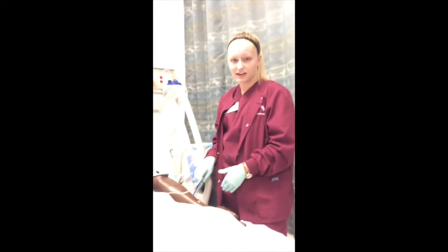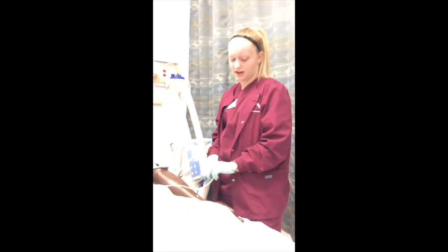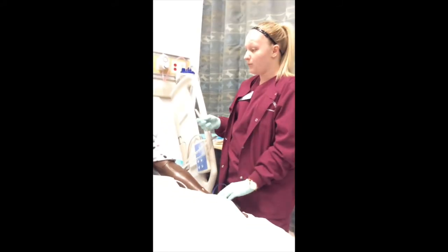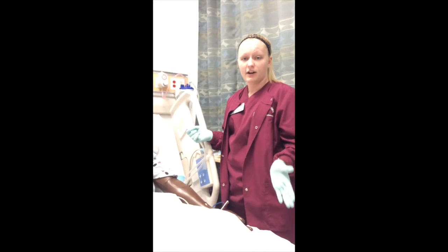Okay, so now I'm going to demonstrate the removal of an NG tube. So the first thing I want to do is make sure that this patient's NG tube is supposed to be coming out. Usually the doctor will have us take suction off for a little while and have them start eating and stuff like that to make sure that they can handle the NG tube being taken out. And so this will probably be disconnected for a little while.